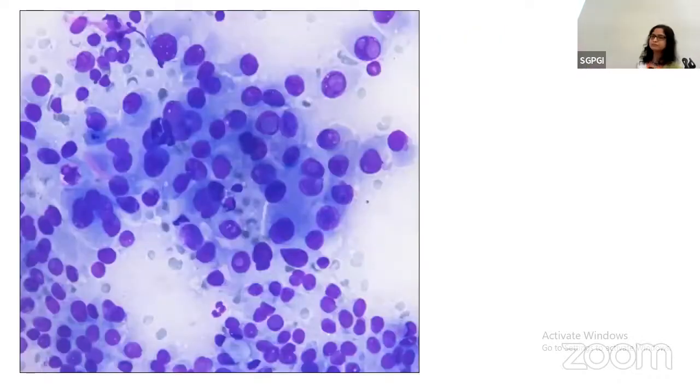Case number 15. So I think one of you needs to take this up. This is an interesting common case. I should not say interesting, maybe a common case. So what we were seeing was from this side.